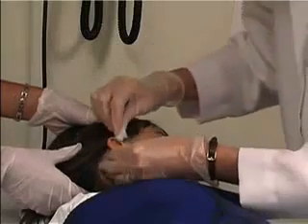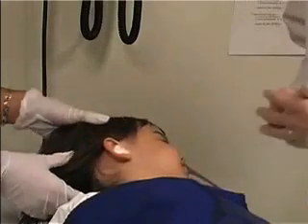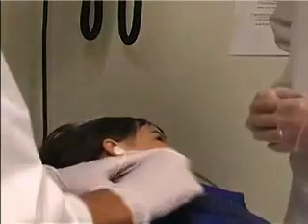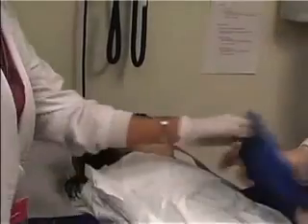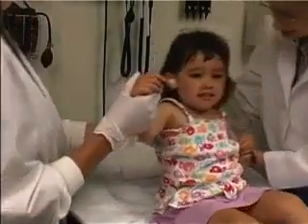In case of profuse bleeding from either the external auditory canal or a high-riding jugular bulb, the external auditory canal can be packed with a cotton ball soaked in oxymetazoline. Having the child sit up and having the parents soothe the child to reduce the pressure caused by crying may also help reduce bleeding.